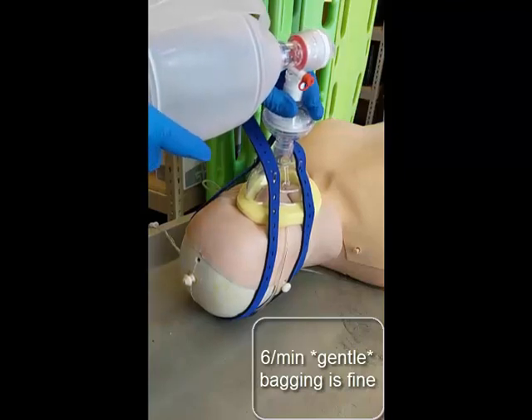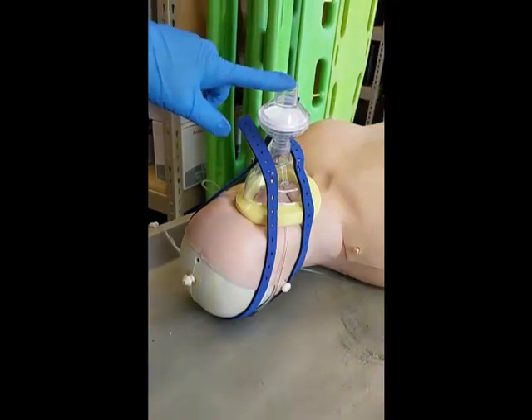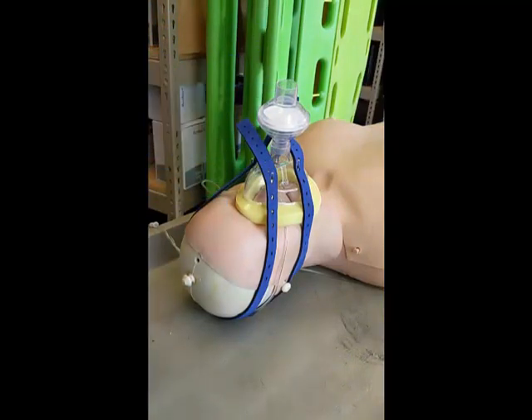Again, at any point, if the bag needs to be removed, remove it from the viral filter. Remember, do not remove the viral filter from the mask itself.